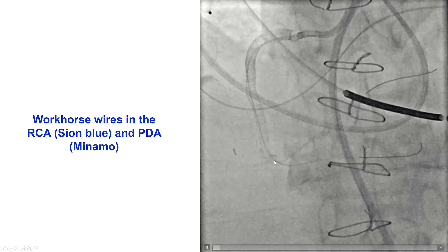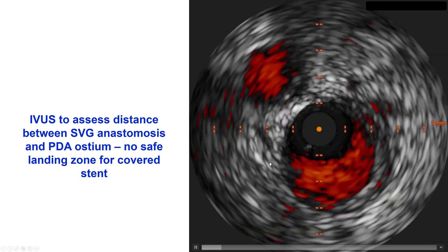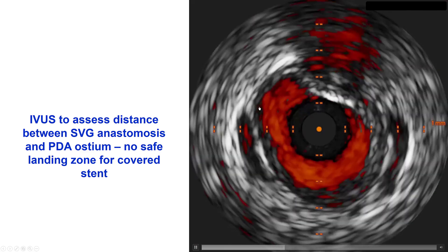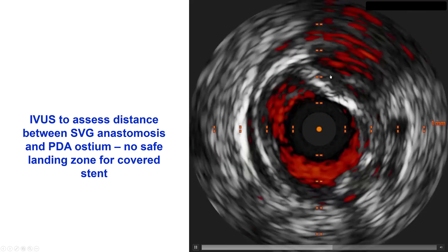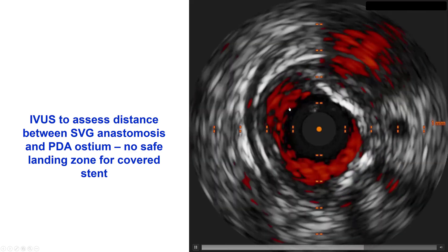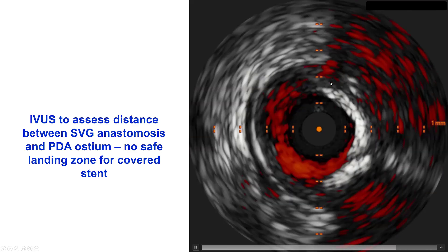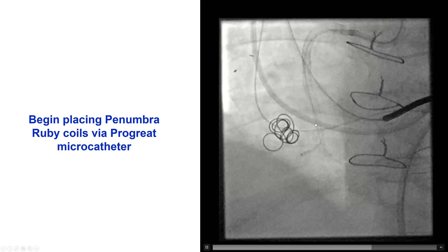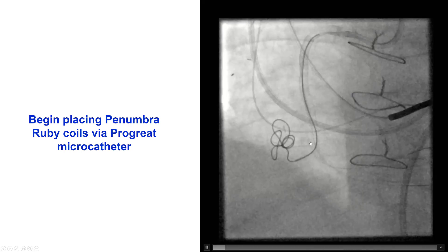We inserted guide wires into the right coronary artery and the PDA into the right posterolateral. We then performed IVUS to determine the relationship between the PDA and the SVG. The origin of the PDA was very close to the entry into the saphenous vein graft. Originally, our plan was to place a covered stent across the origin of the SVG, but the problem was that if we did that, there was a good chance of losing the PDA.